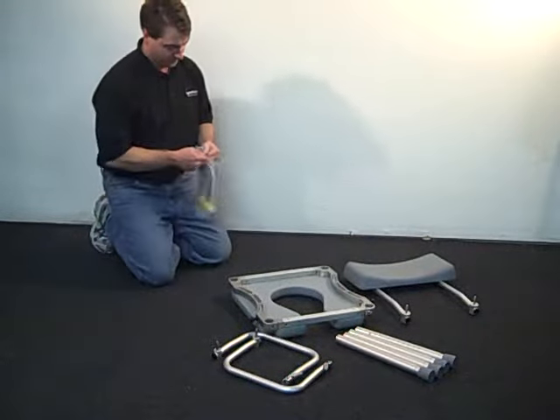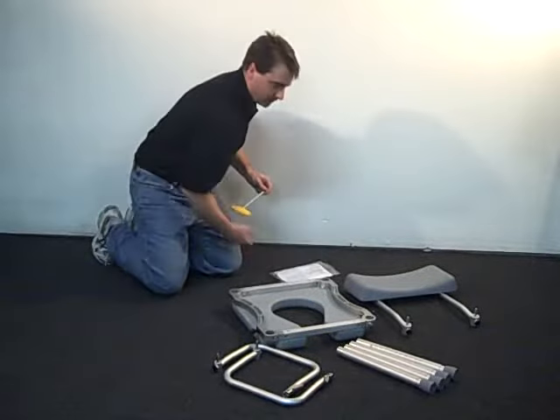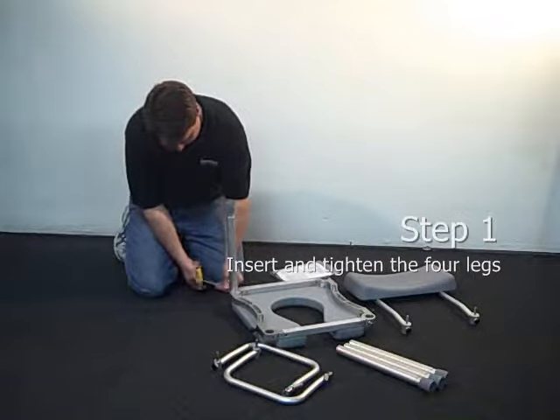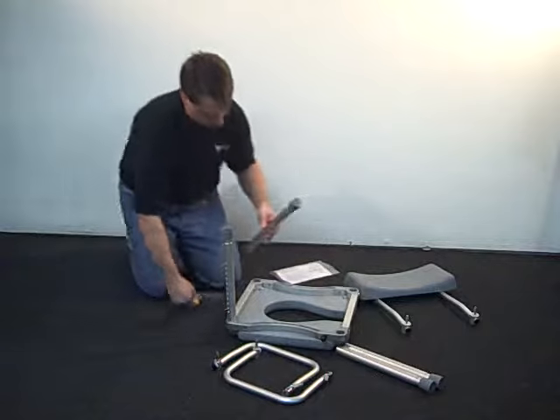Position the seat frame upside down and install the four legs. Note that the top of each leg has a machined portion approximately one inch wide. The top end of each leg should fit easily into the socket of the frame. Make sure the legs slide home into the sockets.